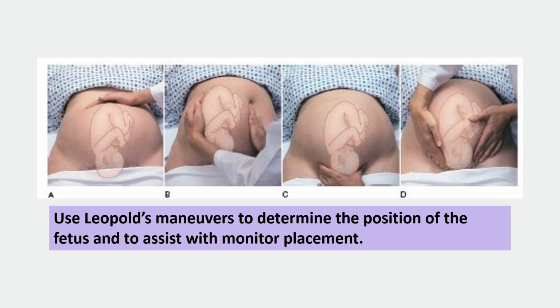Okay, you want to move down her belly to the sides. What are you feeling on each side? If you feel something firm and hard, that's probably the baby's back, okay? And that's where you want to place that fetal monitor, because that's where it's best heard. All right?